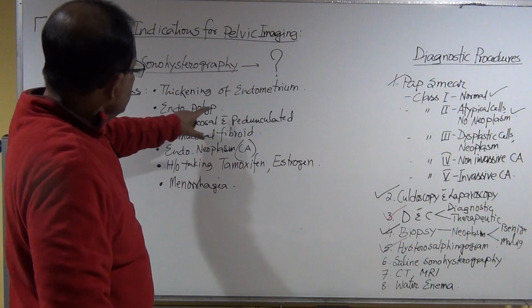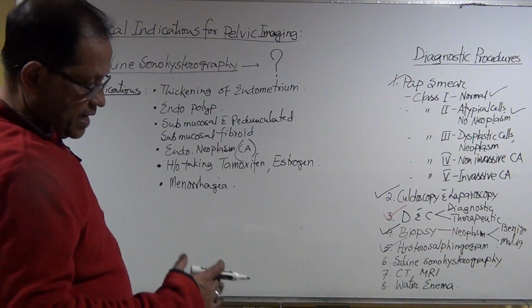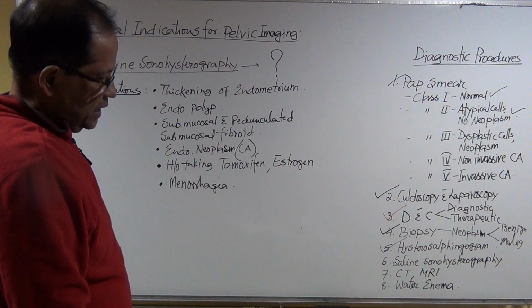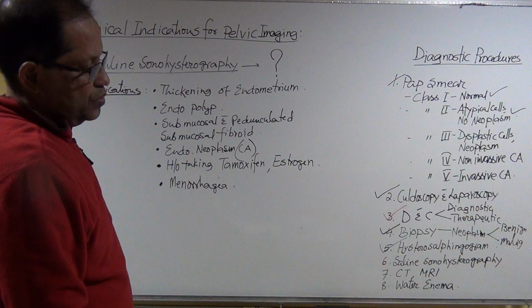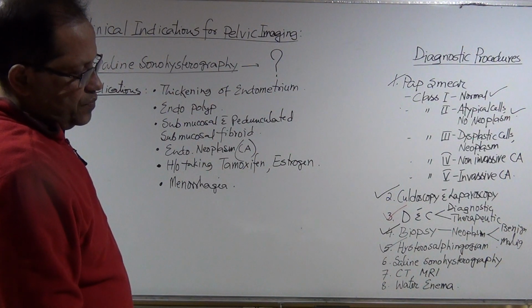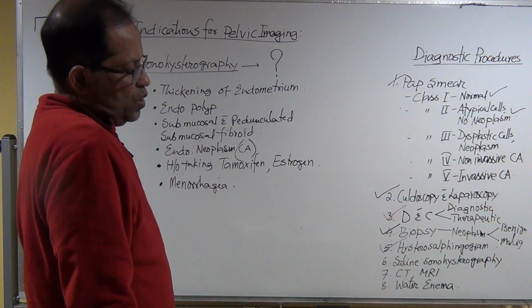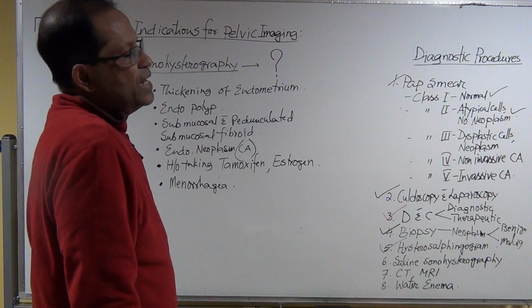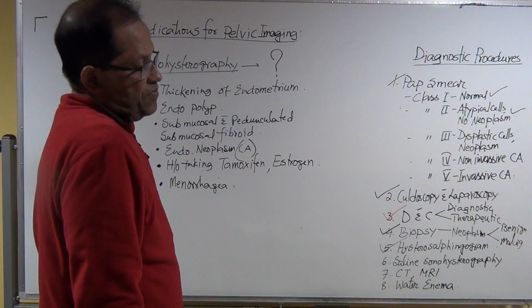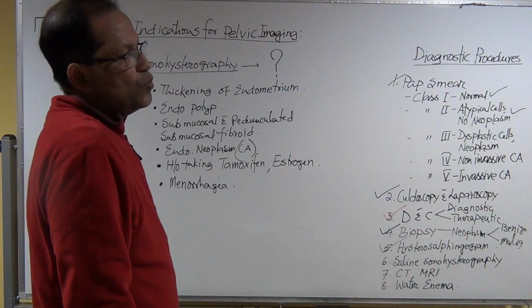So in this examination, they like to see, is that endometrial thickening, which is unusually greater than 1.5 centimeter, due to a growth, endometrial cancer, or due to a polyp, or simply thickening of the endometrium, or there is a pedunculated fibroid. Then how can we rule out?